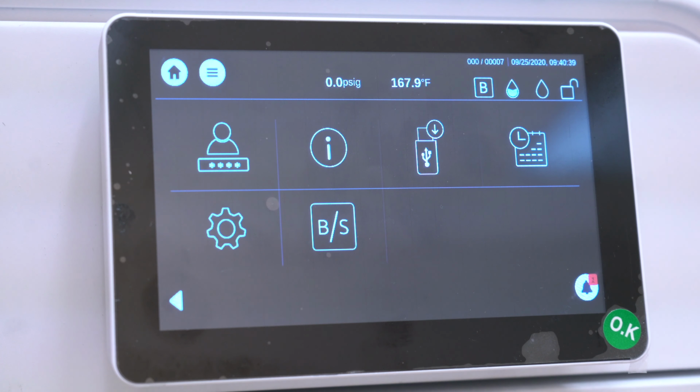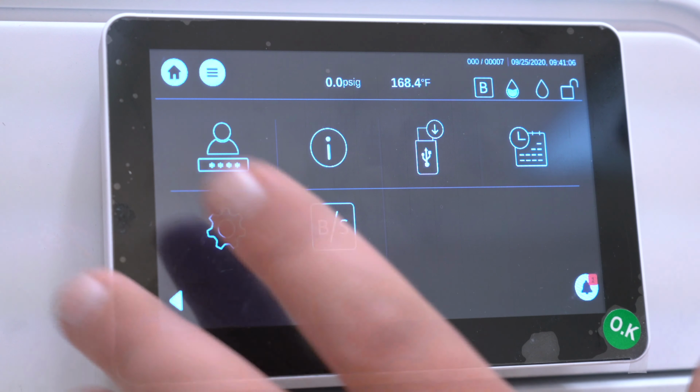We are the only company that can sterilize 99% of all instruments on the planet. The only thing we cannot sterilize are flexible scopes. Other than that, rigid scopes, hollow lumen instruments, solid state instruments, everything can be done in a T-Edge. It's definitely a game changer in the market.